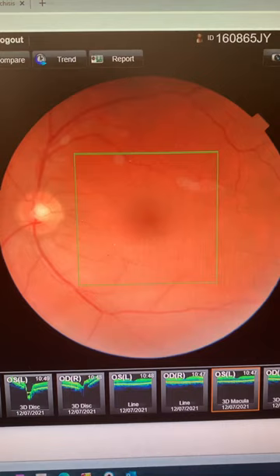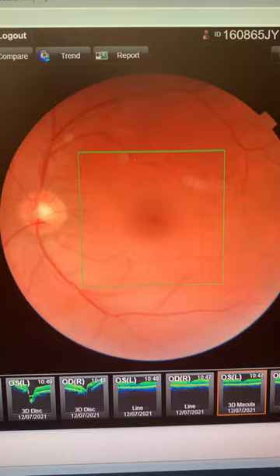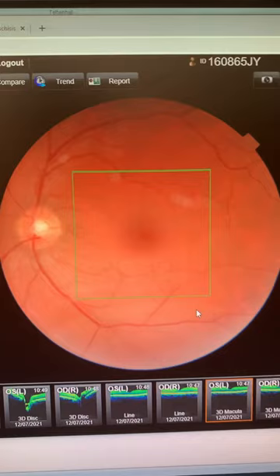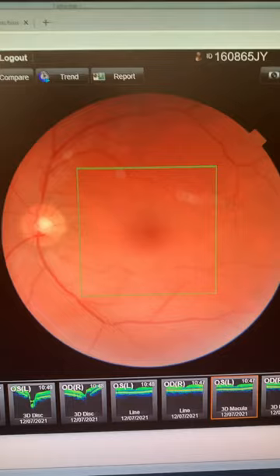2D photographs like this are pretty useful because we've got a physical picture of what the eye looks like, but more importantly we need to see what's going on underneath the surface. The best analogy is to think of this as the front cover of a book — we need to see what's going on inside the pages.